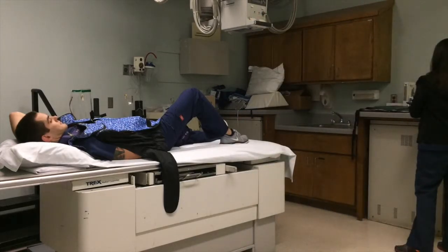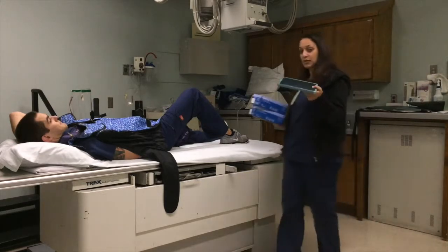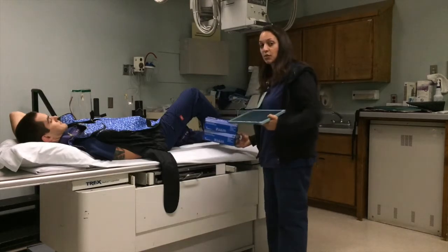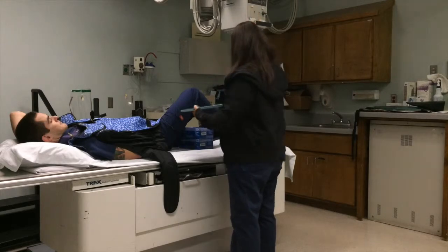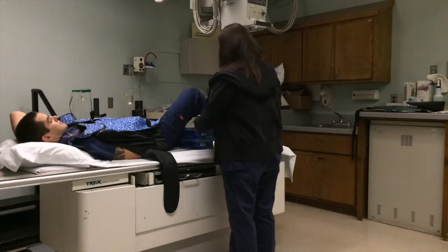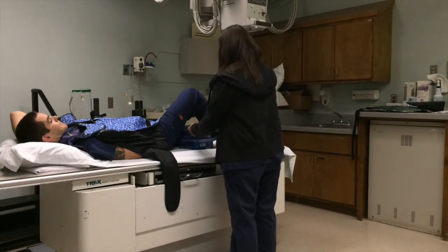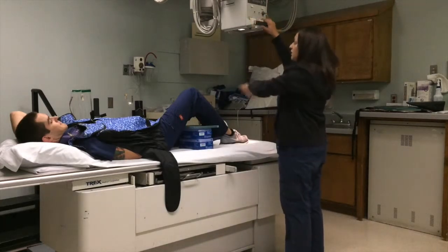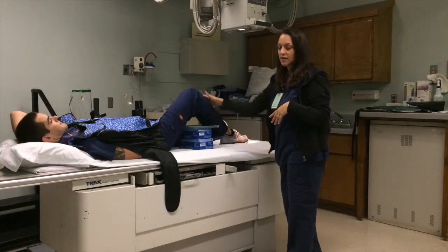I'm going to grab an 8x10 film, and then I'm going to build up the IR to his kneecap, because it's going to go underneath the posterior portion of his knee. So I'm going to slide this under. This is going towards his right side. I'm going to push it a little bit there. That looks pretty good. The central ray is going to be perpendicular with the angle of the tibia.